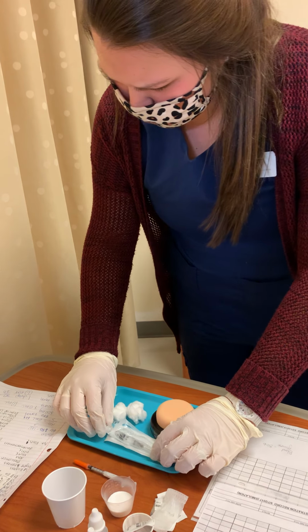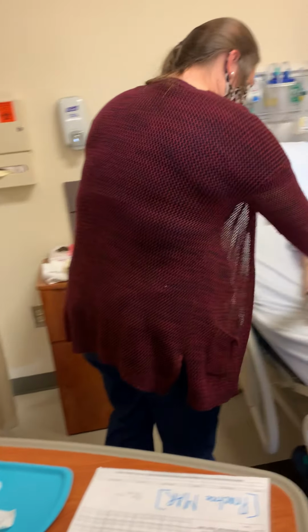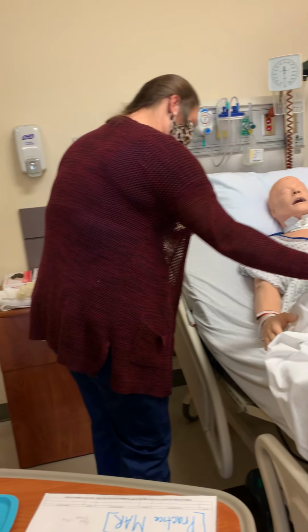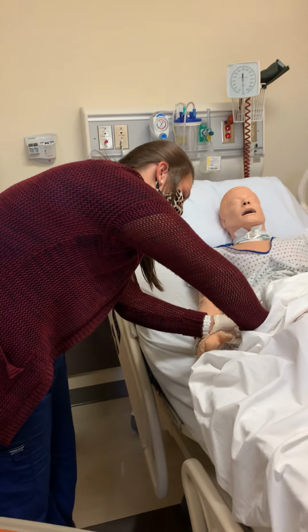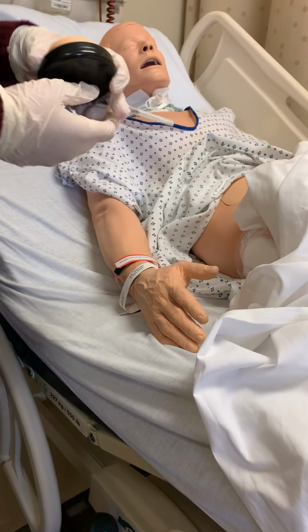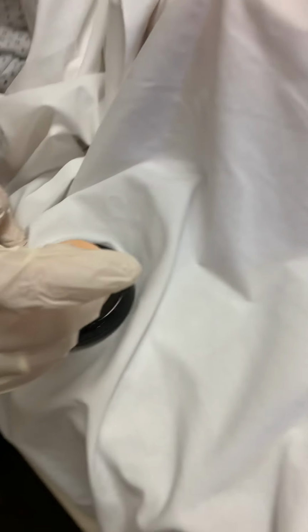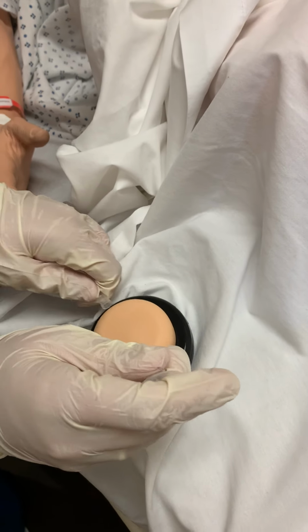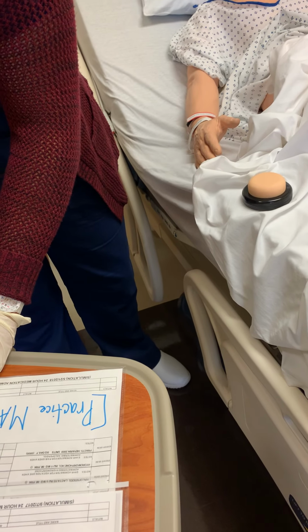We're going to do this ventrogluteally. So this is going to be the area in between the middle of my index finger. So I've cleaned the site. So I've administered that.